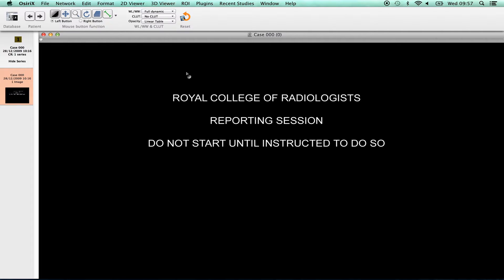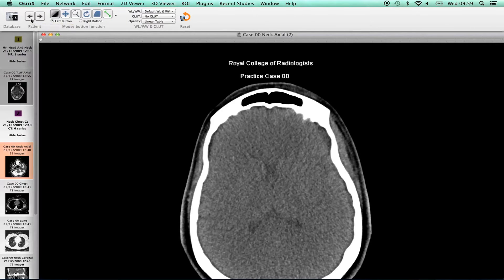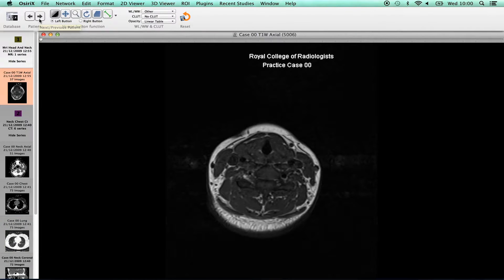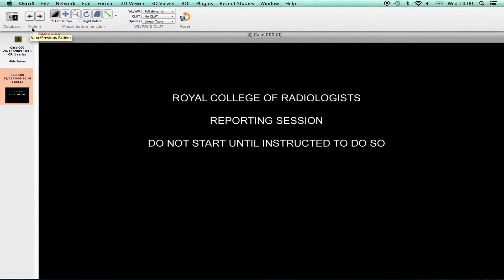Candidates must not proceed beyond the start screen until instructed to do so by the invigilator. Candidates viewing the first examination case prior to the start of the examination risk being disqualified. Candidates can move through the cases sequentially, both backwards and forwards, using the patient arrows or by clicking on the database button to access a list of all the cases in the examination.